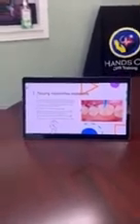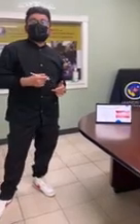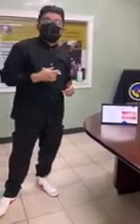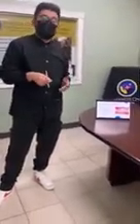Once the dentist has applied the primer agent, we must use the curing light to set the primer. Next, we have to transfer a new and clean microbrush applicator to the dentist so he can apply the bonding agent. Once he has applied the bonding agent, again we must use the curing light to set the bonding.